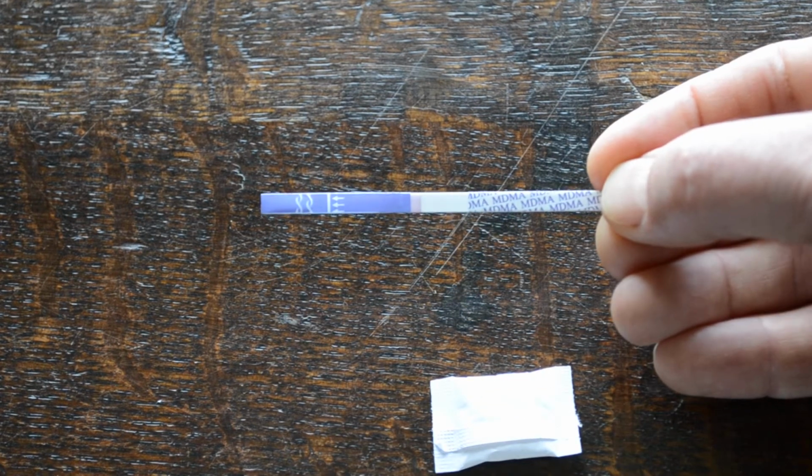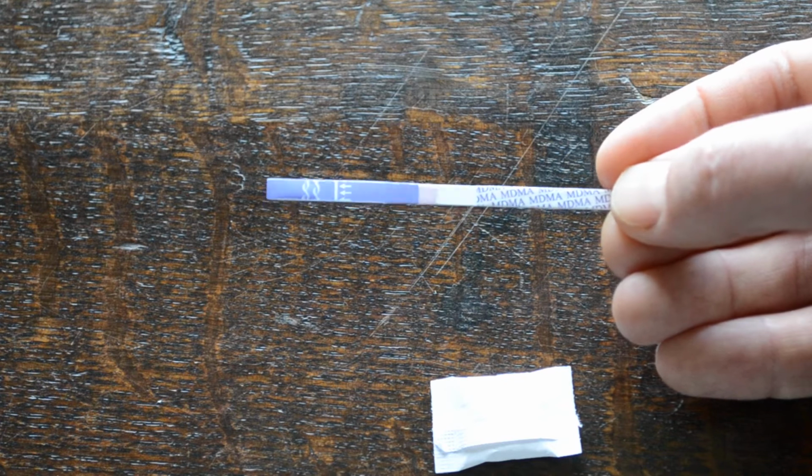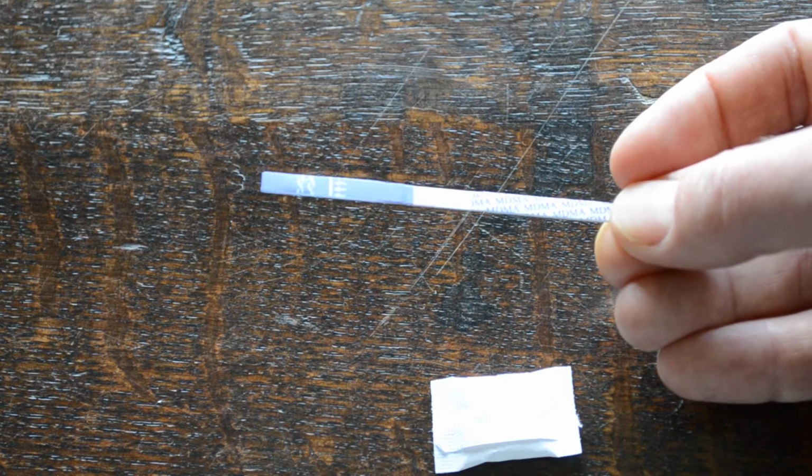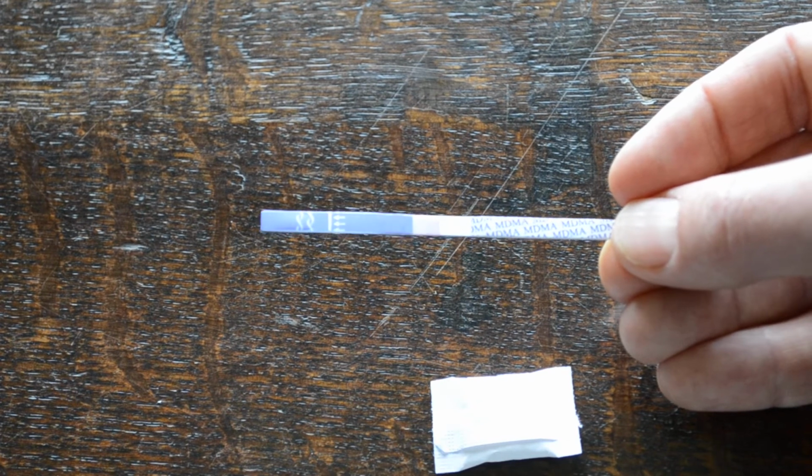dipping these tests for between 5 and 10 seconds, just until enough moisture is absorbed onto the test strip. And then what you'll see starting to develop in this test strip is it's absorbed the sample, and if you can see coming up the central portion, the flat white portion, you'll see that pinkish band of colour just osmotically travelling up the test strip towards the handle end that I'm holding.